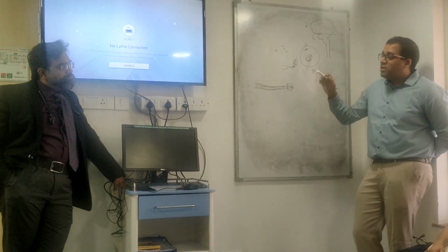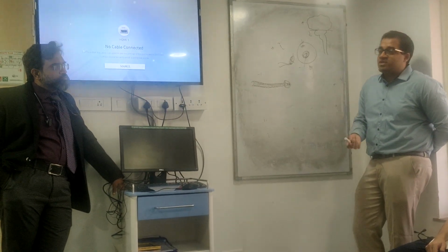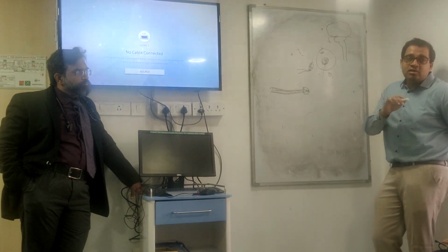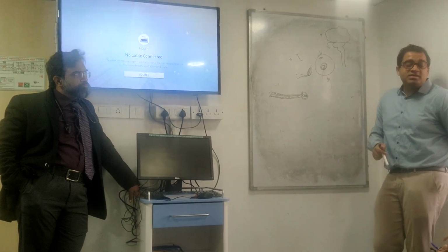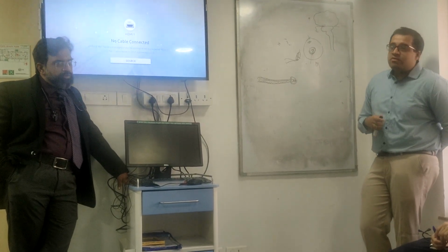Colony count, again, there are no established guidelines on the blood. They say every blood culture growth is significant. So usually you will see colony count in tracheal secretion, in urinary tract samples, but anywhere else they will not usually give you a colony count, because any growth is significant. 100 colonies of Staph aureus is significant versus 10,000 colonies of something else. So somehow quantification of blood culture is not favored usually.